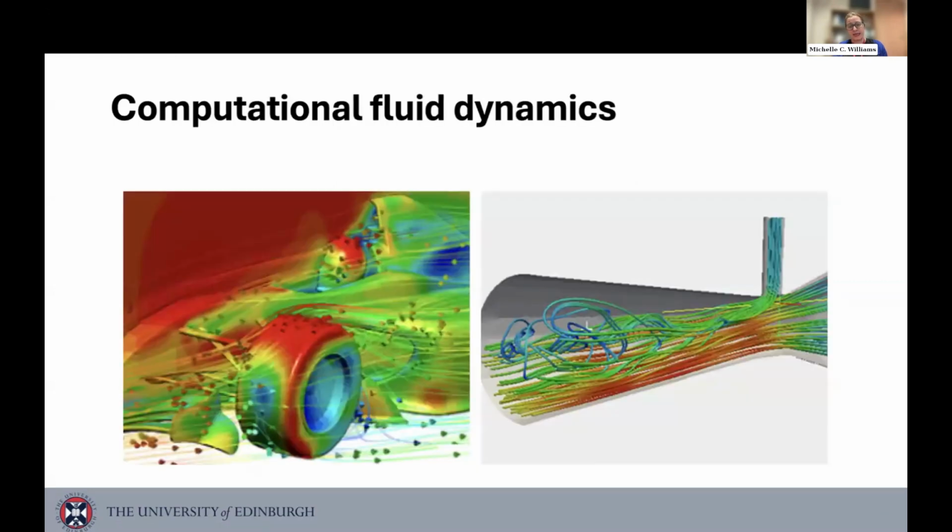But more recently, techniques have been developed using computational fluid dynamics to model this from resting CT coronary angiography. So it's not an actual measurement that we're making, it's a model and synthetic calculation that we're using the anatomy to tell us with some very complicated computing. And the sort of stuff that we're using, this CFD stuff, is the sort of thing people have been using in engineering for a long time. So wind tunnels, sports cars, this is the sort of maths that we're talking about here.